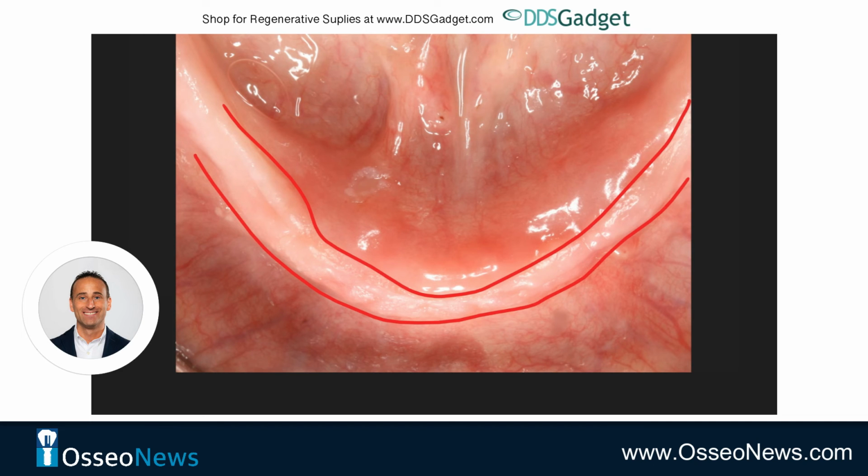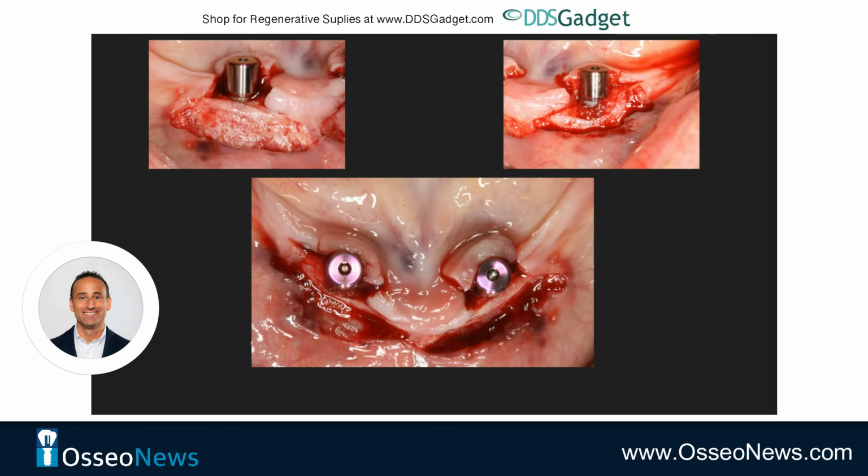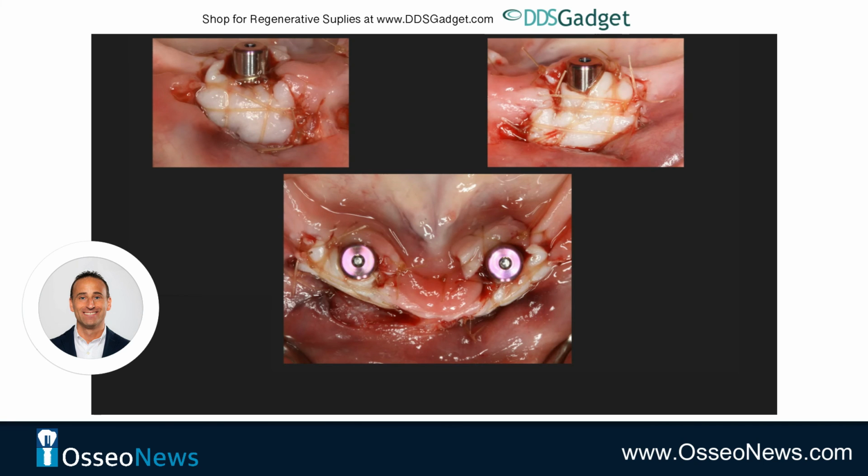And so the plan here was to take whatever keratinized tissue is present, push it lingual, and do a free gingival graft on the facial of the implants at the time of uncovery. Made a full thickness incision at the level of the mucogingival junction, pushed the keratinized tissue lingually, exposed the implant, and placed healing abutments, and then just went ahead and prepared recipient beds on the facial for the graft. Employ the same method in terms of adapting the grafts to the facial of the implants, mattressing over them with some gut sutures.